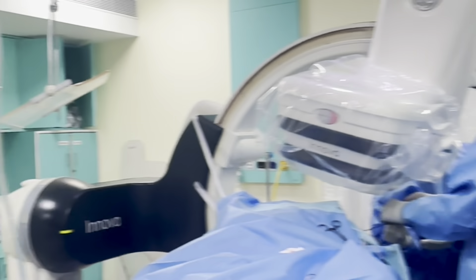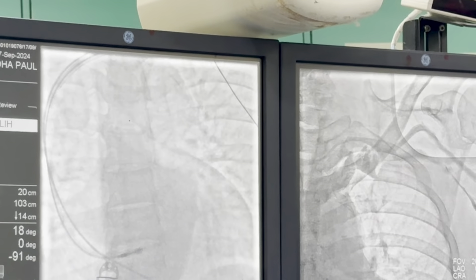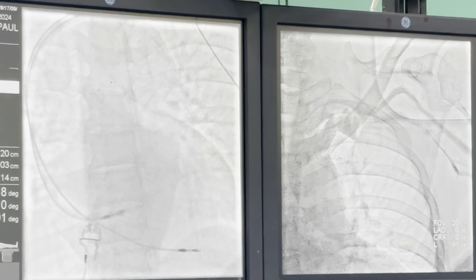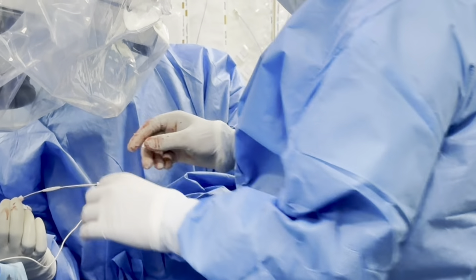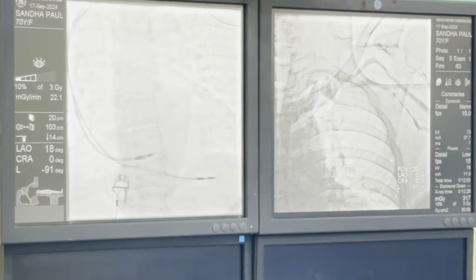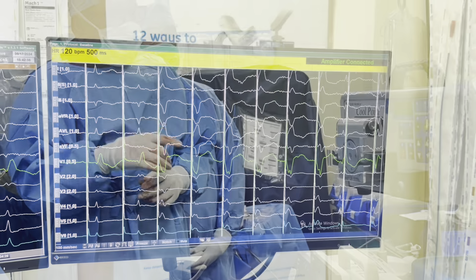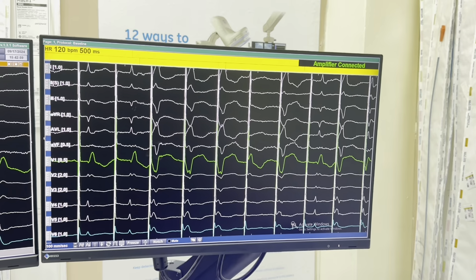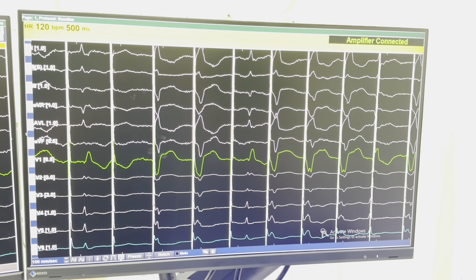Now the lead is touching the septum and we will try to face here. In unipolar configuration, we will see what kind of intracardiac electrograms we are getting. Now we have the unipolar connections — this is the tip. We are pacing in unipolar fashion and we are on the right side of the septum. Now we are recording from the right side of the septum. Lead 2 is up and leads AVR and AVL are recording. In V1 you can see the W pattern.